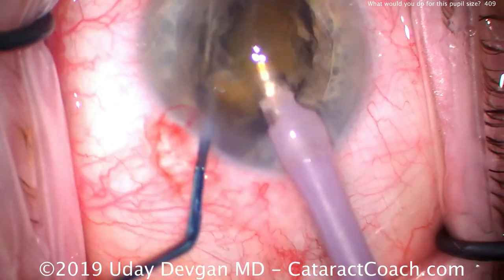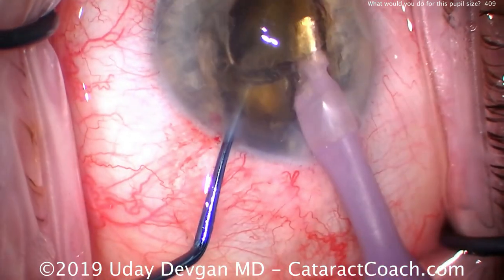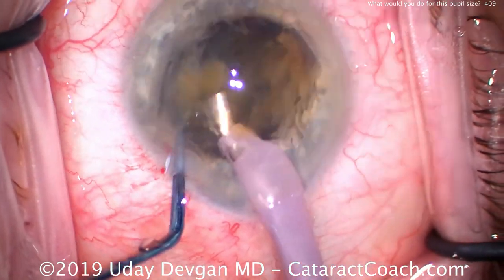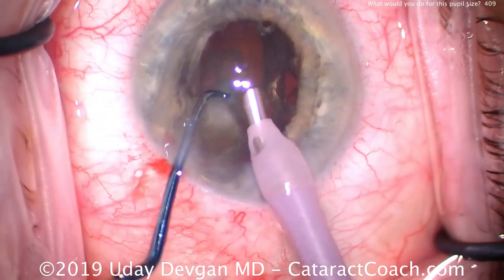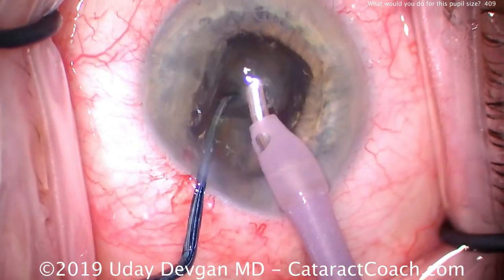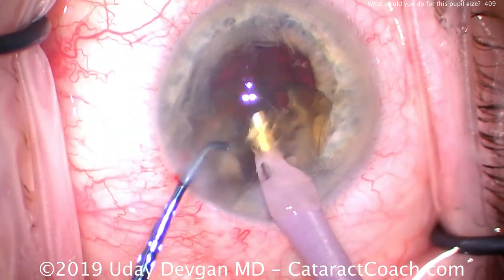Now that we have two halves, we can emulsify the first half. You can see this patient has a reasonable amount of nuclear sclerosis — it's not a very soft cataract — but yet we can apply a very minimal amount of phaco energy, using mostly aspiration with some phaco power modulations. We're able to emulsify the first half relatively quickly. Here's the second half, which we chop again into quarters and emulsify each quarter.